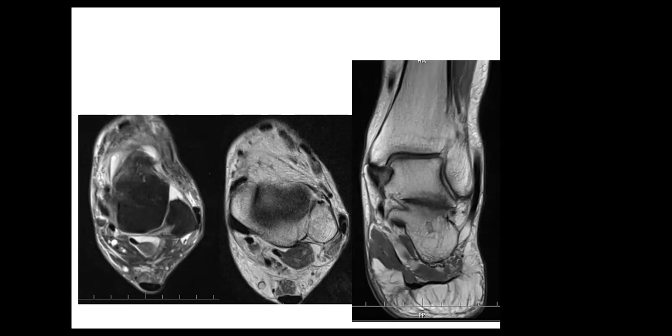So you can ask the patient, you put your hand on the plantar aspect of the foot, and you ask the patient to push your hand. While they are doing plantar flexion by pushing your hand, you scan the peroneal tendons, and you ask the patient to dorsiflex and plantar flex against resistance, and your hand will be the resistance. So that's how you reproduce peroneal tendon dislocation.